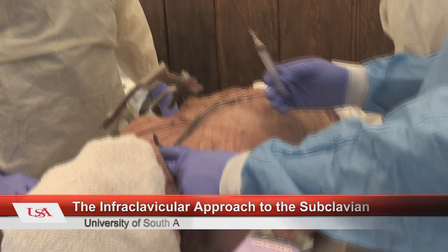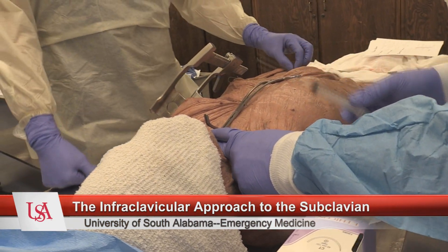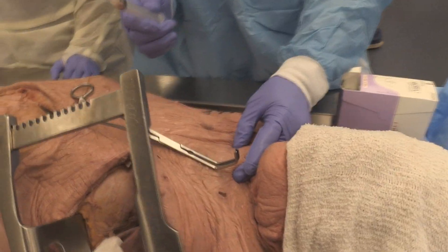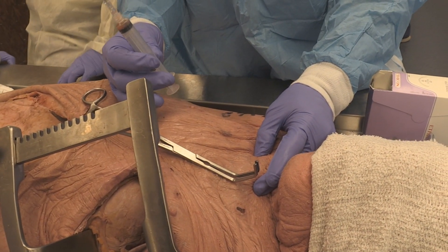I am showing the infraclavicular approach to subclavian. This is my modified approach. Most people who do the subclavian approach try from here and go straight there, but I'm afraid to do that because of pneumothorax. So I tried this technique called riding the clavicle.